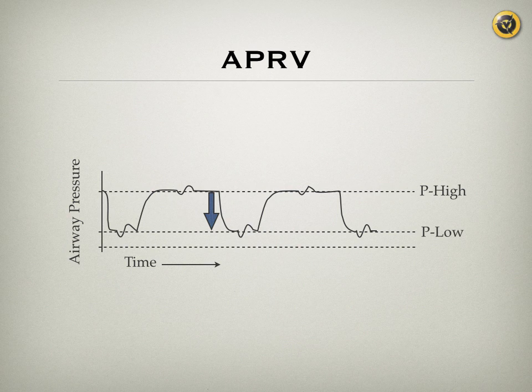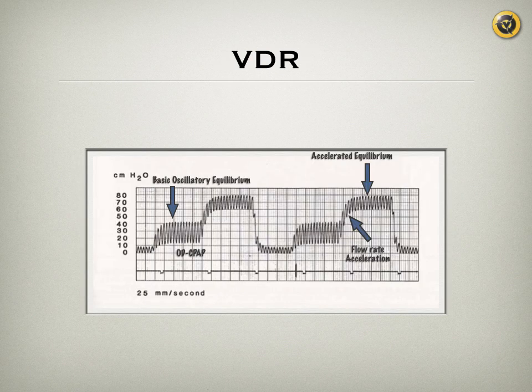Now, VDR, or volumetric diffusive respiration, is a combination mode. It's a ventilator invented by Dr. Bird, who is also a brand of ventilators. This ventilator was invented for military fields, and it's totally pneumatic. And what it does, it combines two things.